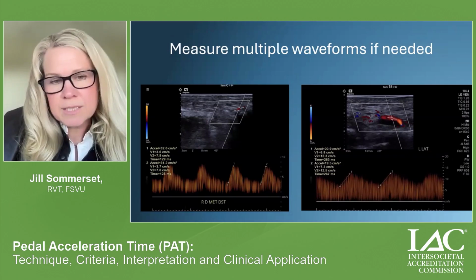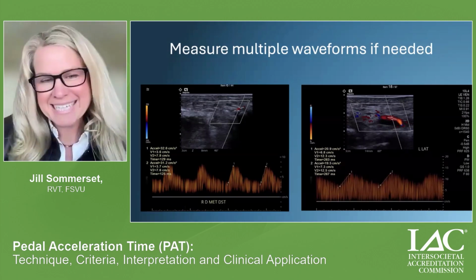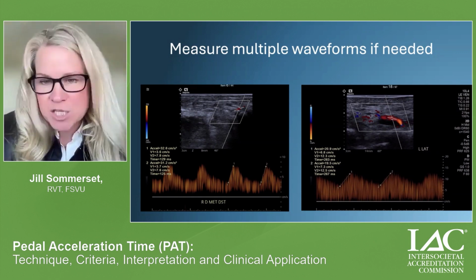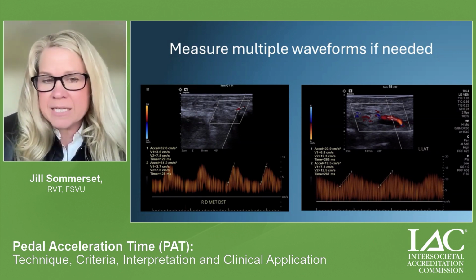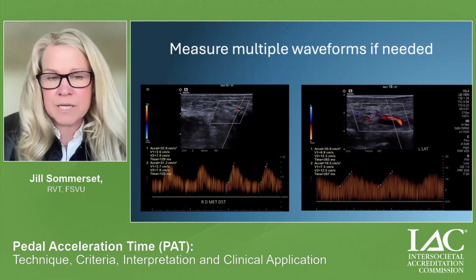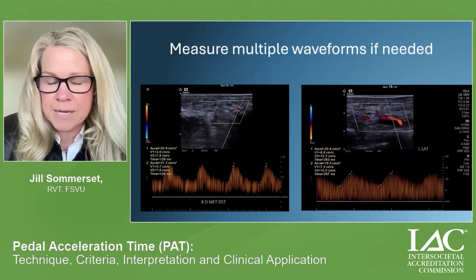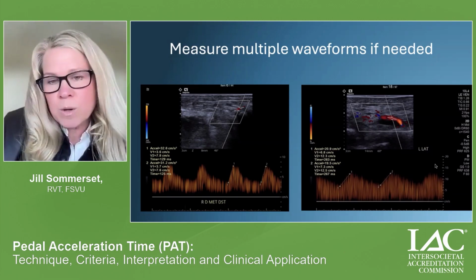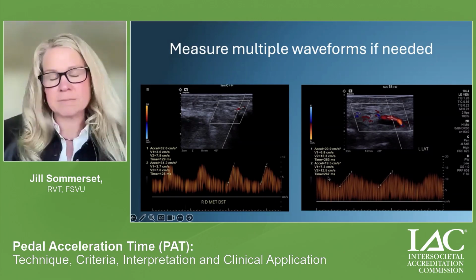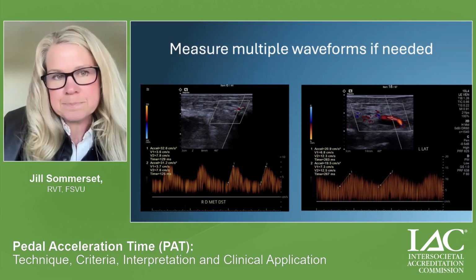If you're concerned about your measurement, it is okay to measure multiple acceleration times in the spectrogram. I think it's important because this is not always perfect. These waveforms can be challenging to measure. And if you do that, you want to report out the worst PAT value of that waveform spectrogram.